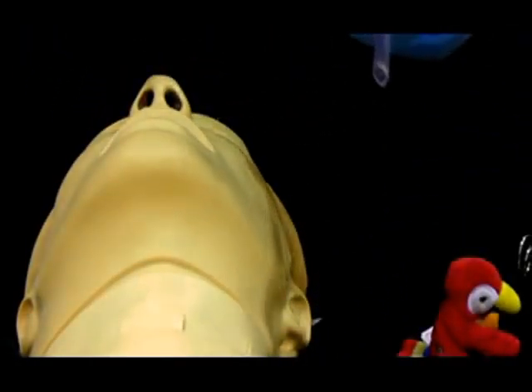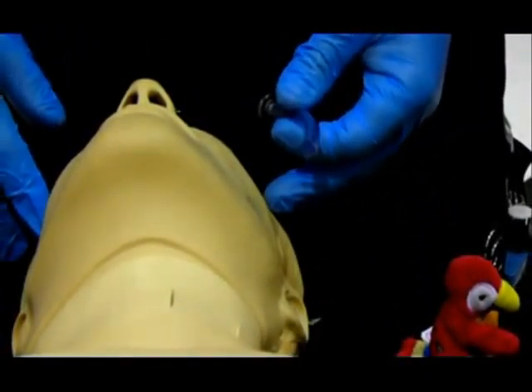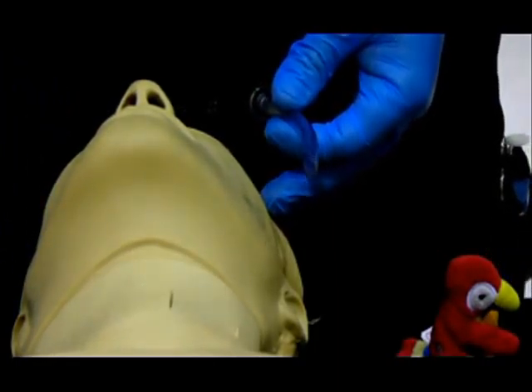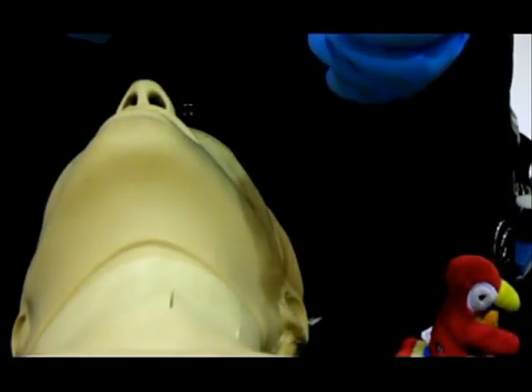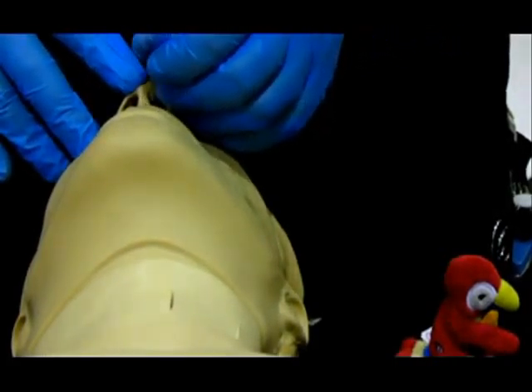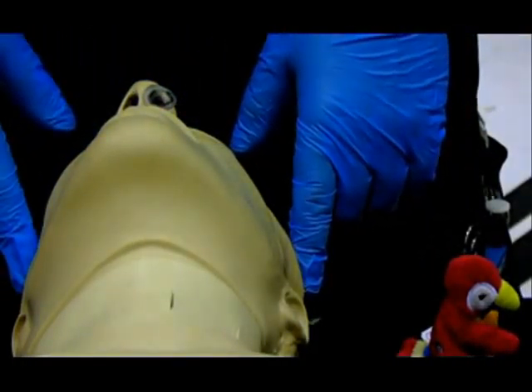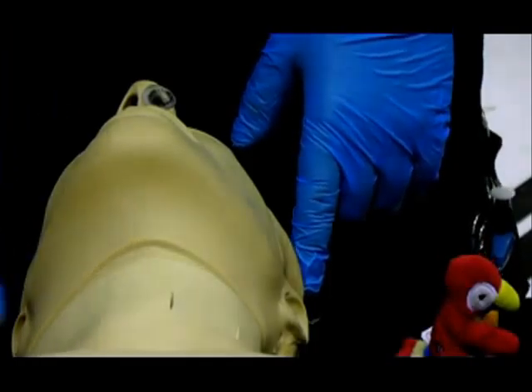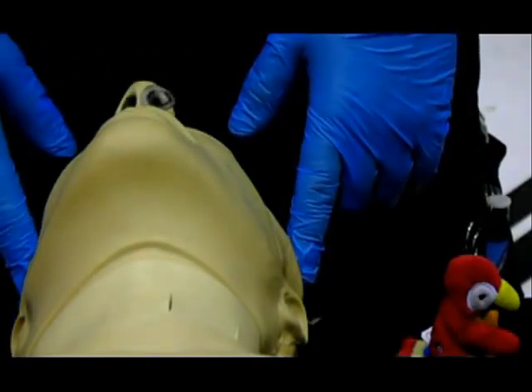Upon insertion, if there is no history of trauma, hyperextend the patient's head and neck. Assure or maintain effective ventilatory function. If indicated, hyperventilate the patient with 100% oxygen. Lubricate the exterior of the tube with water-soluble gel to prevent trauma during insertion. Push up on the tip of the nose and pass the tube into the right nostril with the bevel facing the nasal septum, directing posteriorly and slightly rotating toward the ear until the flange rests against the nostril. May use the left nostril if the NPA is impassable via the right. Verify appropriate position by checking breath sounds, chest rise, and airflow at the flange on expiration. Hyperventilate the patient with 100% oxygen if indicated.